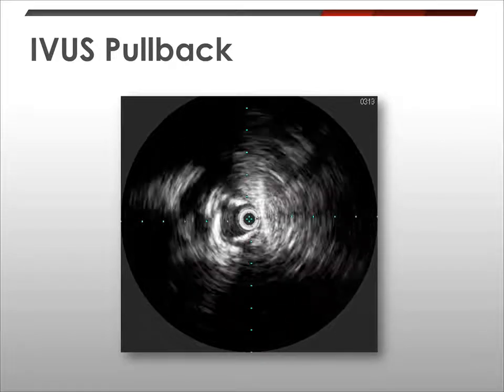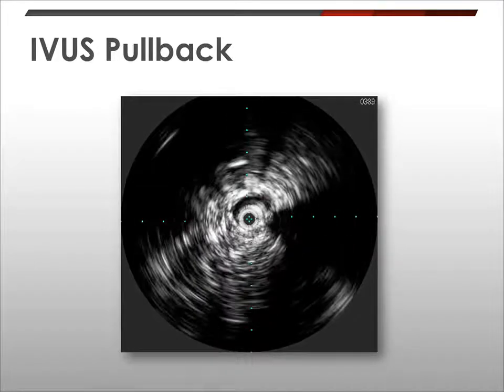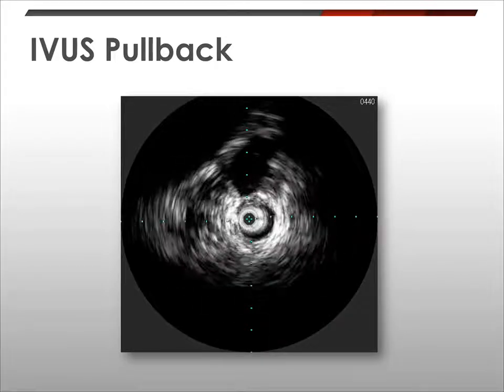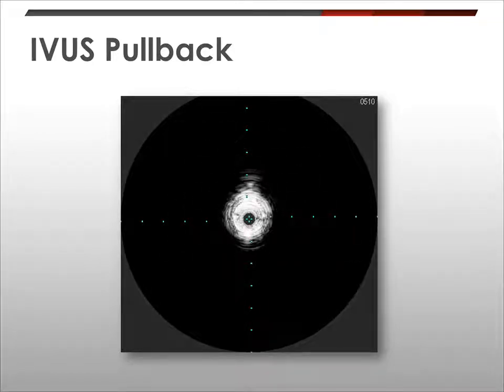It then shows the aneurysm itself along with the amount of thrombus, and then the iliac artery quality and diameter down to the internal iliac artery takeoff, and then the diameter of the external iliac artery to decide which side you want to go up with putting in the main body.